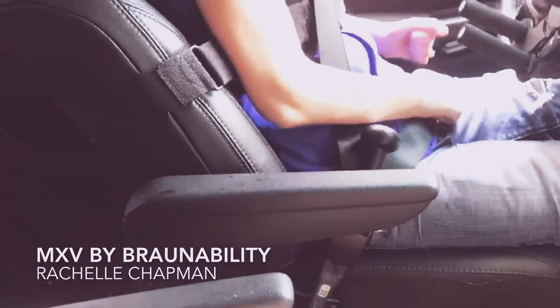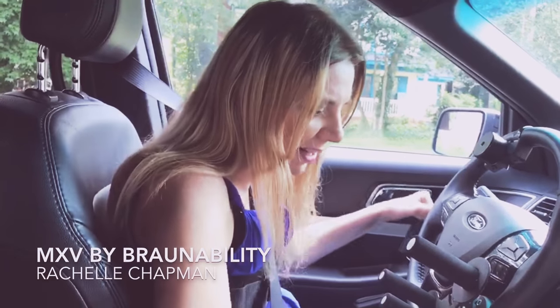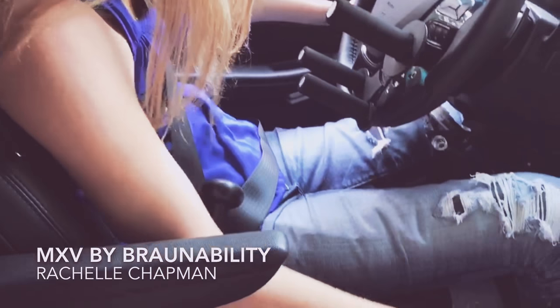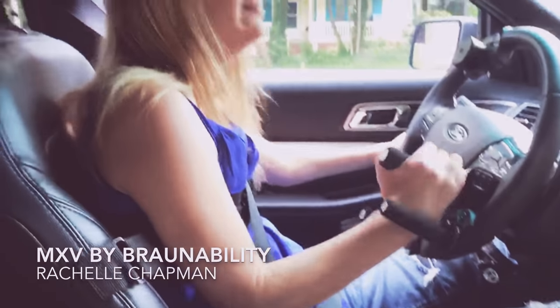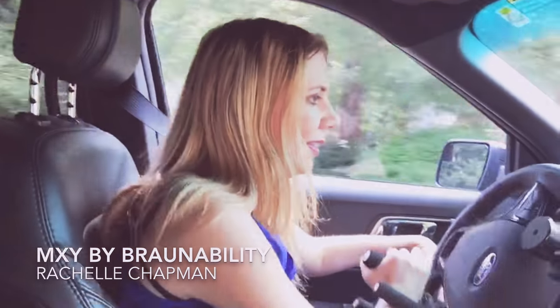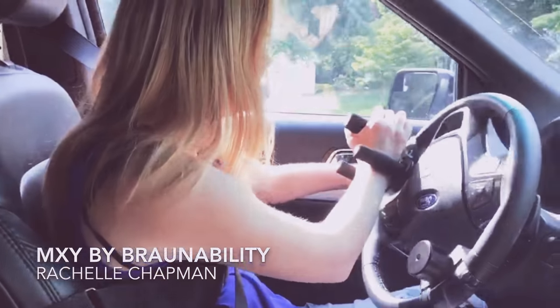So a lot of times I have to use my teeth. Alright, and I'm all secure, so I'm ready to drive. We've already got the car on. I'm going to press the brake and throw it in drive. I've got to get my hand in here, and we're off. And as you can see, this is how I use the steering wheel.